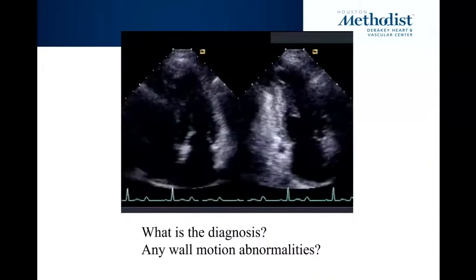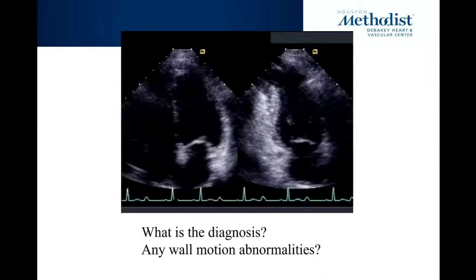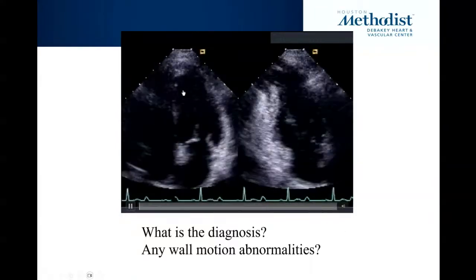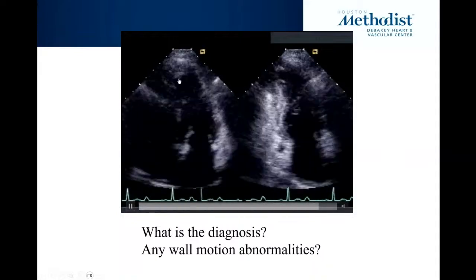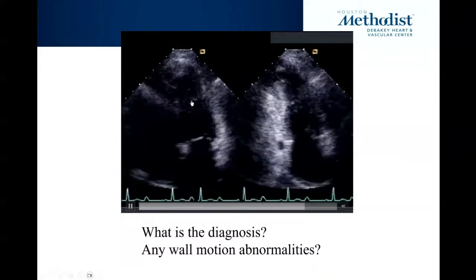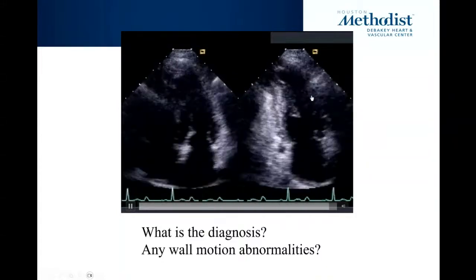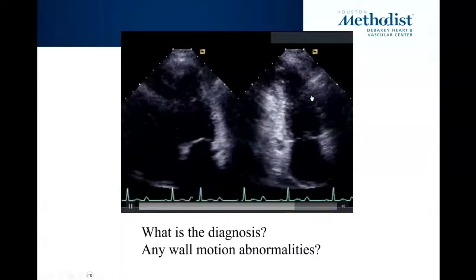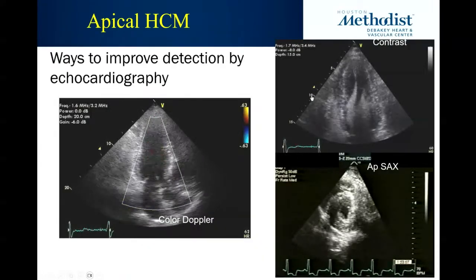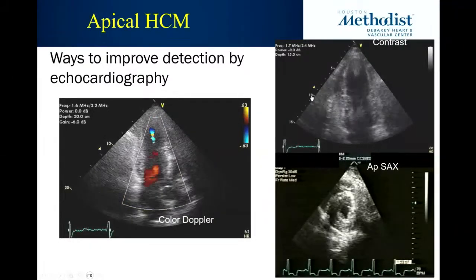And I have seen patients that have come to us with previous echoes done by other people and they have missed it. The reason is that a lot of the muscle in the apex can create an attenuation factor where you don't really see so well. Here, you potentially might be suspecting it, but really this doesn't hit you in the eye. So what are the tricks to reduce the probability of missing it? And this is for the sonographers in the group.